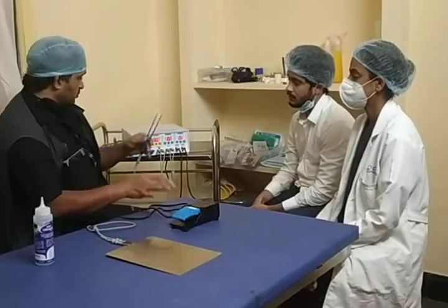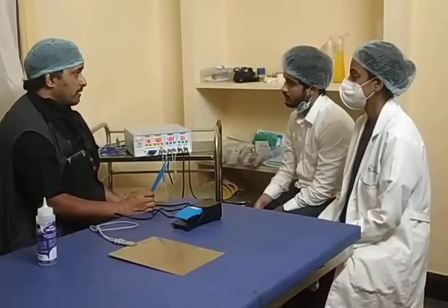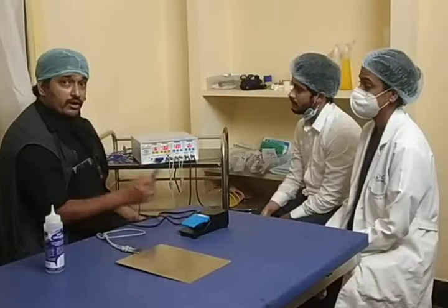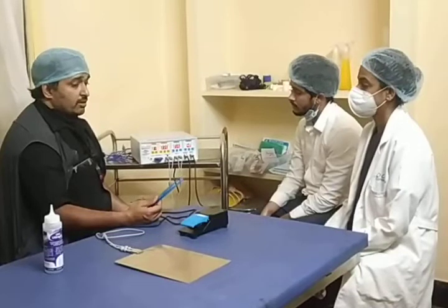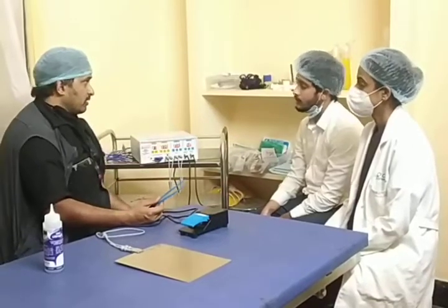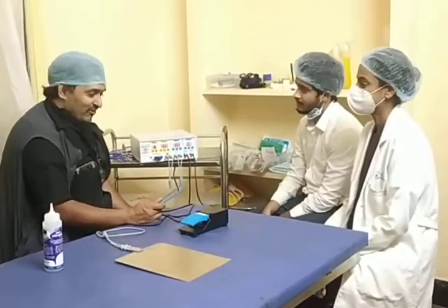So this is in short about the cautery unit, and it is going to be useful for arresting bleeding, especially if you have a diffuse blood supply or tumors or warts or places where you can't use suture materials. And yes, it does cause delayed wound healing because of the use of heat and electricity, and you should not be using any inflammable solutions when you're using cautery. That's very important, that includes spirit and any inflammable antiseptics that we have. And make sure that the earthing is on, you don't want to get electrocuted. Don't worry, you won't die out of it, but definitely it's going to give you a shock.